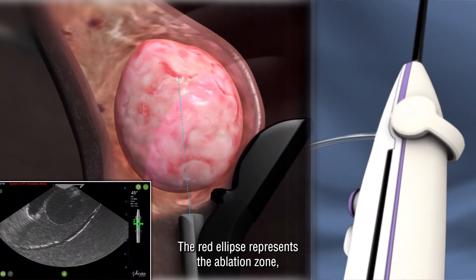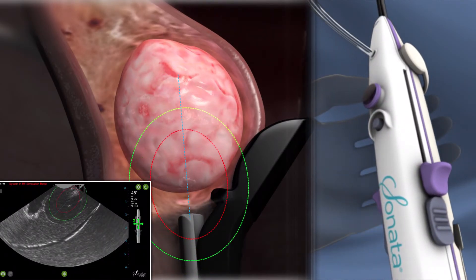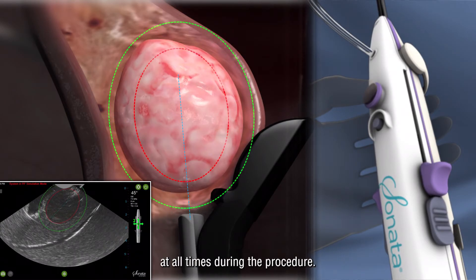The red ellipse represents the ablation zone and the green ellipse represents the thermal safety border. The thermal safety border must stay within the serosa at all times during the procedure.